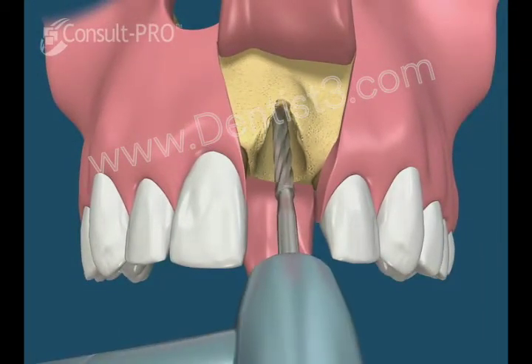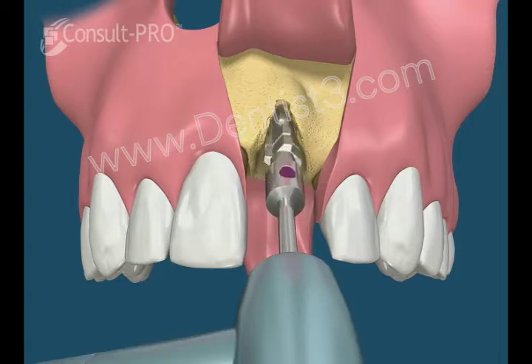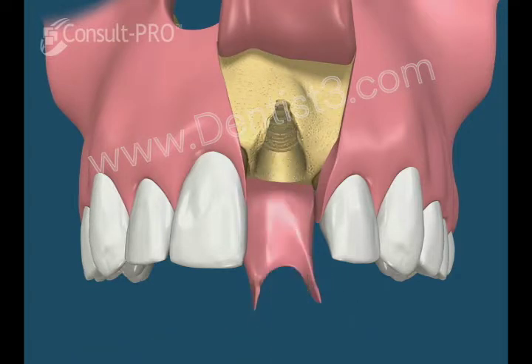An initial drill is used to decide on the depth and angulation, followed by increasing size drills to slowly prepare the area.